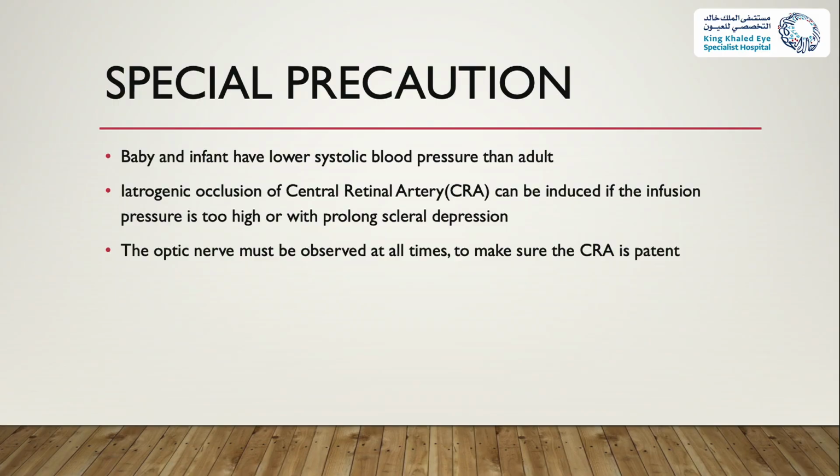When you want to take a look in detail, you stay there, and that maneuver can potentially close the central retinal artery. So always remind the fellow, you're here to examine, do it quickly. You're not here to enjoy the view. Move on as quickly as you can, because the longer you stay in one spot with the scleral indenter, the more likely you may cause some perfusion problems.